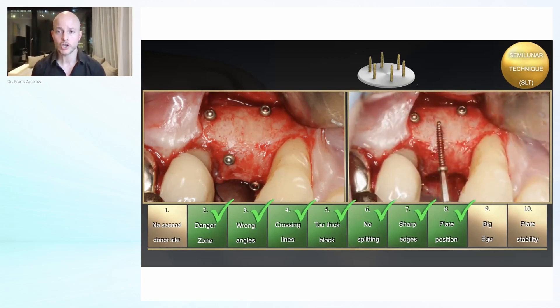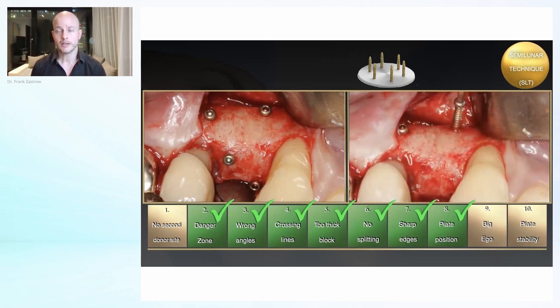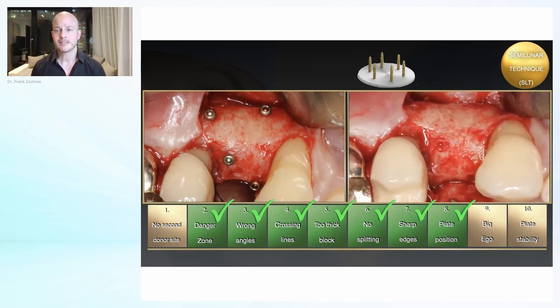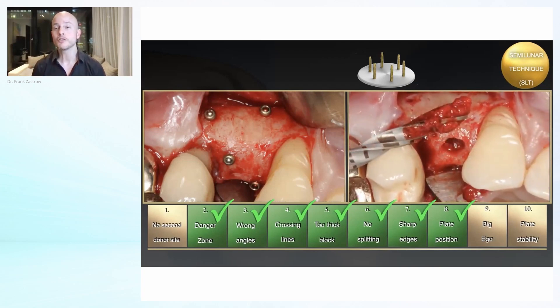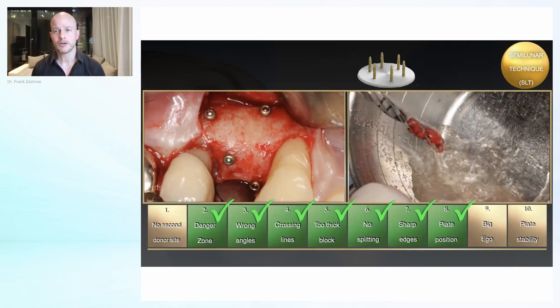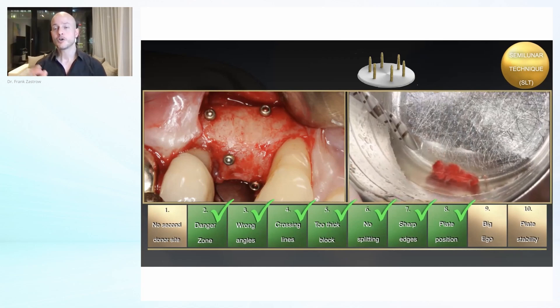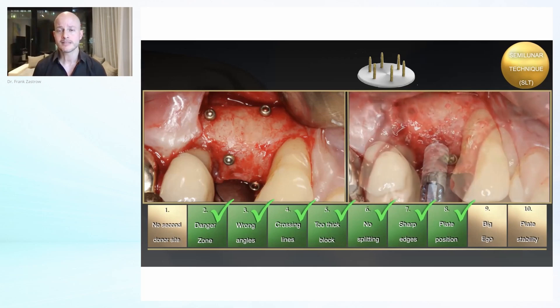You have to give it functional loading now. If you leave it six or eight months, you will also see a resorption process — function loading is crucial. We can now remove the screws. These are the titanium mini screws, anodized, which is why they look golden. You can see the quality of the bone — it's not comparable to bone powder or substitute powder used in GBR technique. We collect all these chips and, thinking autogenous, place the implants.